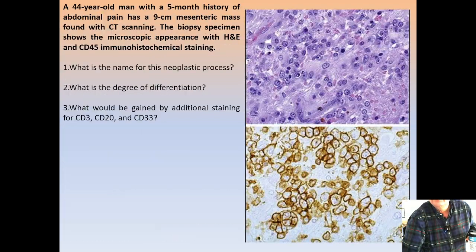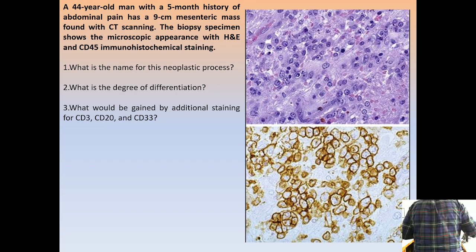Next one. Another staining here. This is a lymphoid marker. We'll study lymphomas from the next lesson. So if we have malignant cells with no signs of differentiation, we test immunohistochemical markers of epithelial differentiation, such as cytokeratin: negative. Immunohistochemical markers of melanoma: negative. Immunohistochemical markers of sarcoma, that means a malignant neoplasm of mesenchymal origin: negative. And we have common leukocyte antigen, CD45. This is positive. So this is a malignant cell population deriving from lymphocytes, from blood cells.